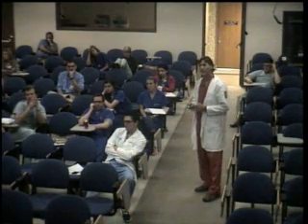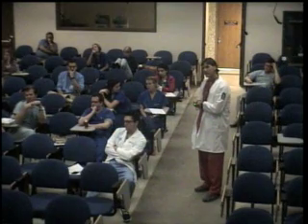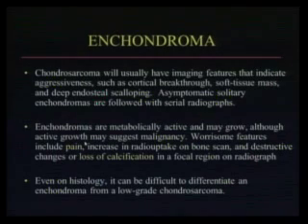So this is a case that Dr. P gave me, and you can see all these lytic lesions here. And you see all the phleboliths because this patient has multiple hemangiomas. They amputated this patient probably because they thought the patient may have malignant transformation. I don't know. So would you recommend biopsy in those lesions? Because some lesions, if you biopsy them, will look malignant to the pathologist, but they're not, and you treat based on the pathology. Yeah, they have some horror stories at ARP.